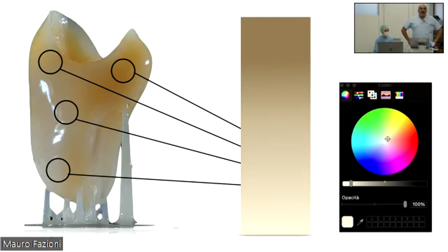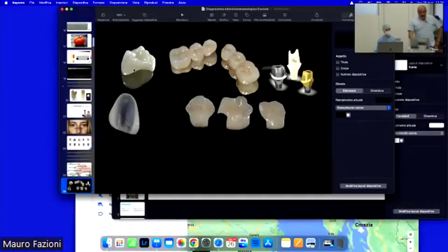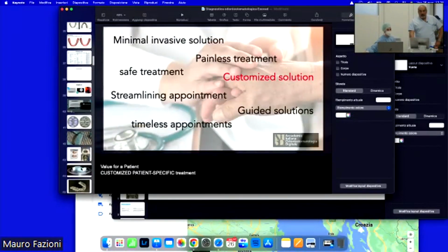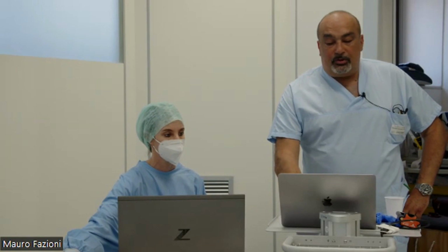This is very important for the performing, okay? This is what our patient asks of us.